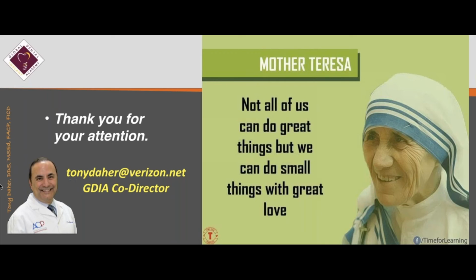The other question: what is the best treatment option for a mandible that has a V shape and a mandible that has a U shape? One to choose ball attachment and one a bar attachment. One of the indications for 3 implants is when it is a V shape. A V shape, you can put one at the apex of the V and one implant on each side. If you do a good custom-made denture, you don't have to have a third implant.